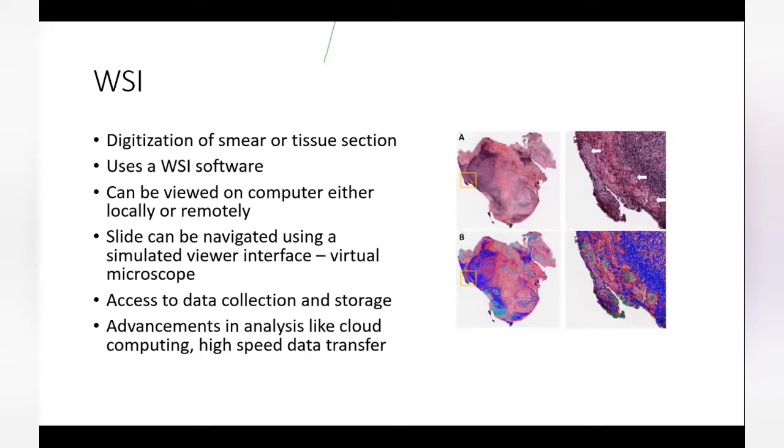Now, why is that important? One can ask. And the first thing that comes to my mind is you will be able to view the slide wherever you want. So you don't have to always be physically co-located with it, which means if I have an advantage of being able to see something, I'm an expert in, say, nephropathology, but I don't have the slide with me and somebody wants to show it to me, or the other way around, I have a slide and I don't have a nephropathologist and I want to share it with them.